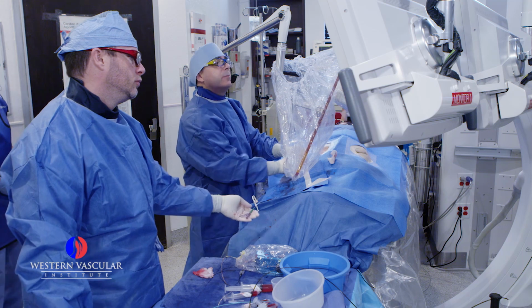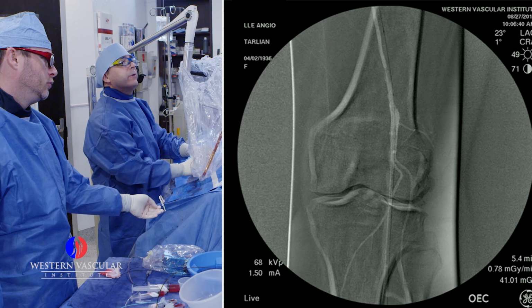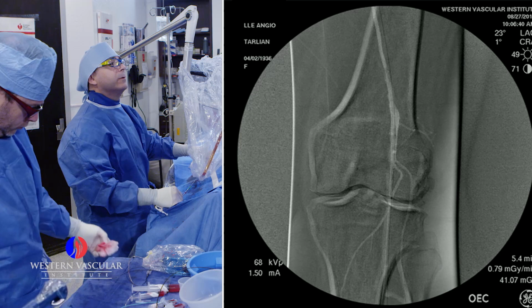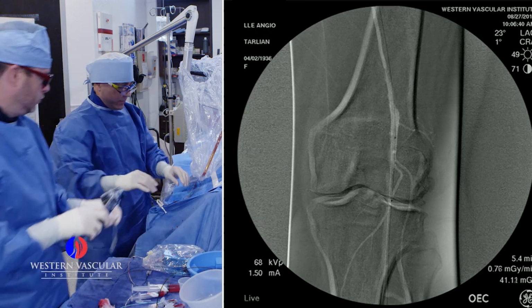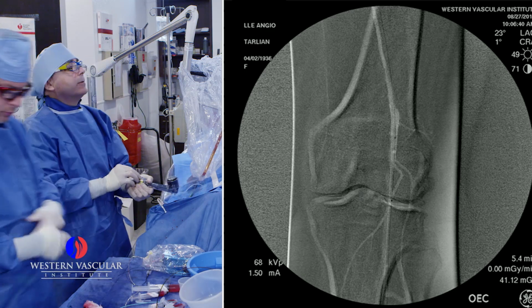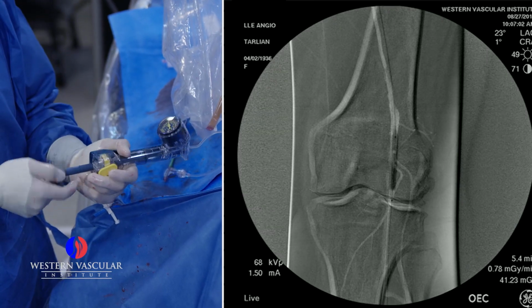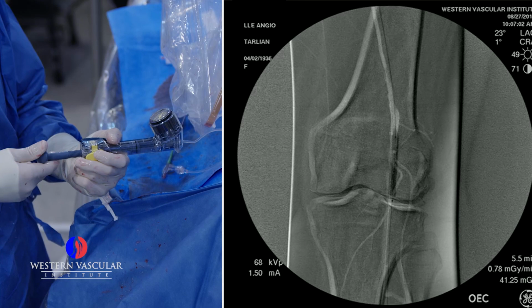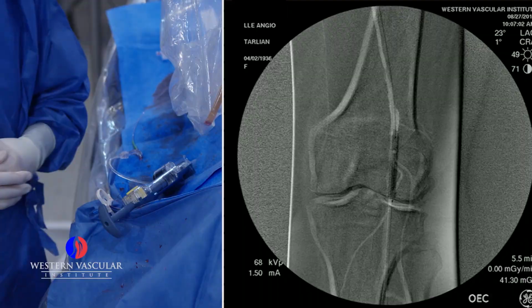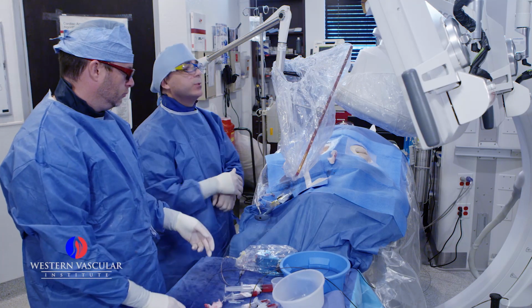This particular type of balloon has a smaller shaft, and it goes through the sheath easier. And you can see the two dots approaching the area in question. And we'll just use that as a marker. We'll inflate the balloon, leave it inflated for about a minute. Go live. Okay. And we'll time that. Standard, typical inflation times that we use are anywhere from 30 seconds to a minute.